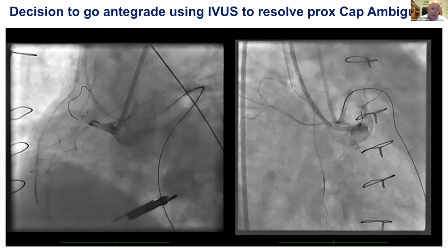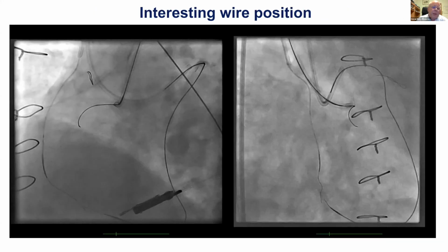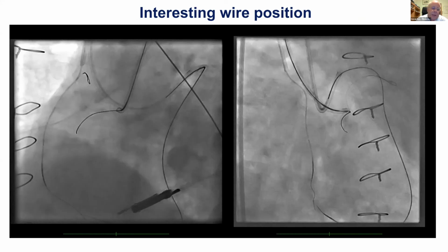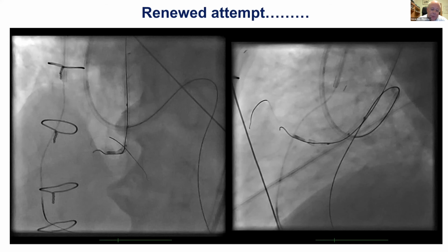It was still very, very difficult to understand where you wanted to have the wire go. But eventually we ended up in one wire position, which was kind of interesting. It's moving so slow, but this wire is really twitching back and forth and obviously not in the right lumen. Eventually we could move some gear forward and change the position or the entry point. And we got another entry point and could get a microcatheter down.